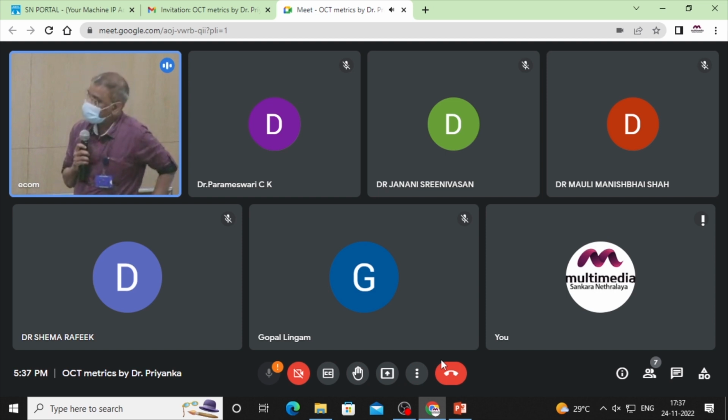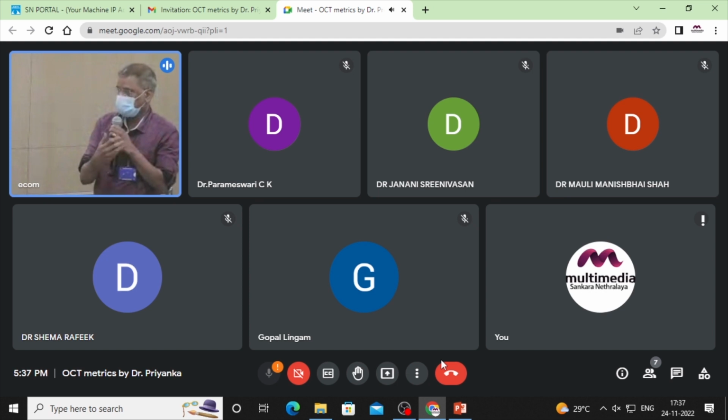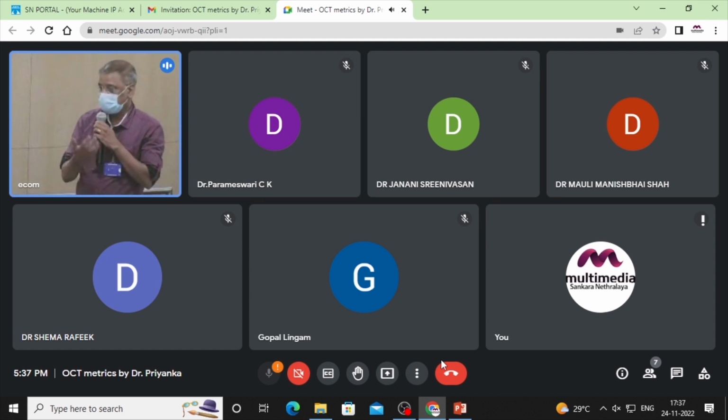And what were you looking at in terms of vasculature? Basically, what we looked at is what the inbuilt algorithm gives, like vessel density and the perfusion defect. In addition, we also looked at the FAZ dimensions. We have not used any sophisticated or external software. We just looked at the inbuilt algorithm, to see how these artifacts are influencing these parameters.